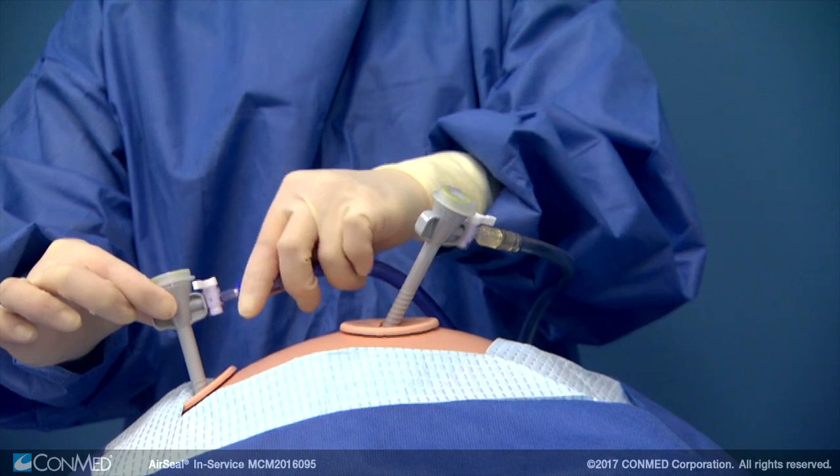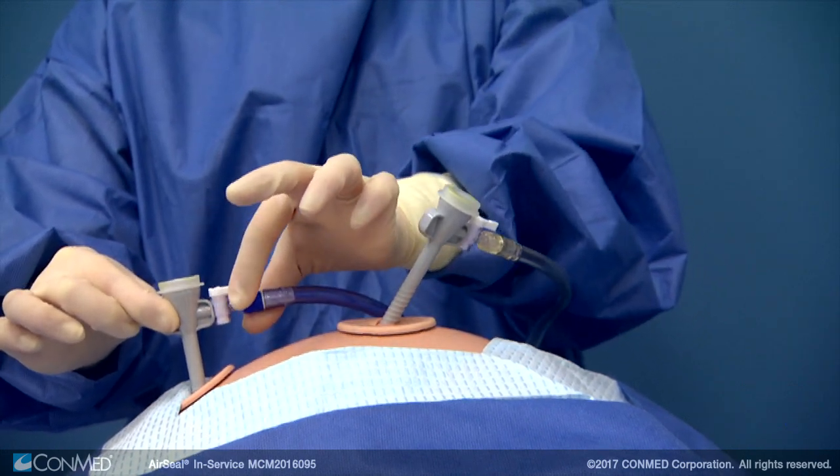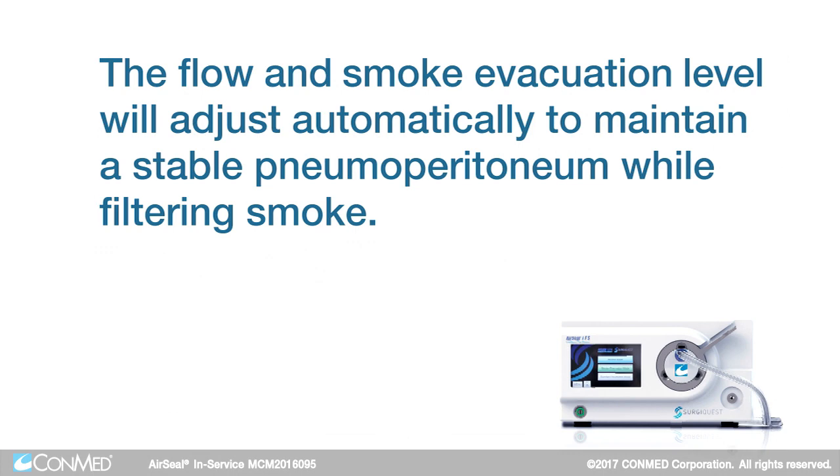With both the clear and blue tubes now connected, smoke evacuation is active and filtering the intra-abdominal gas while removing smoke throughout the procedure. The flow and smoke evacuation level will adjust automatically to maintain a stable pneumoperitoneum while filtering smoke.